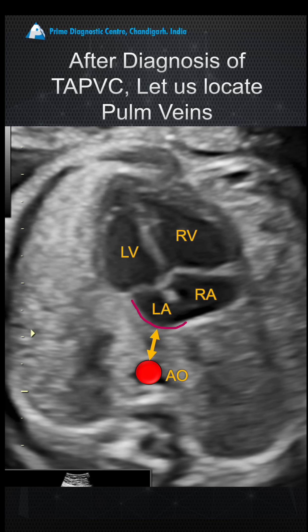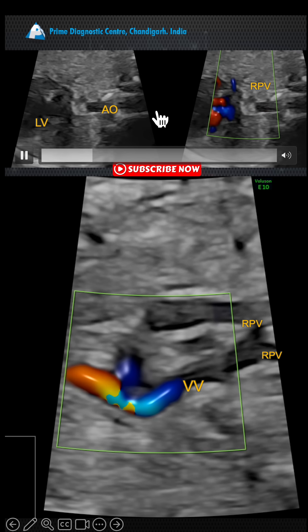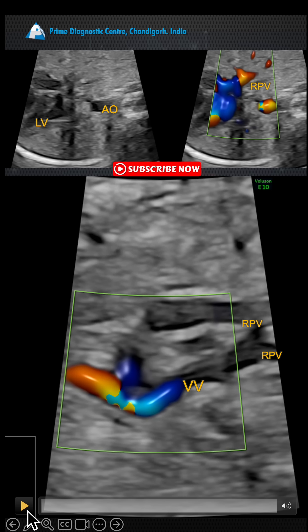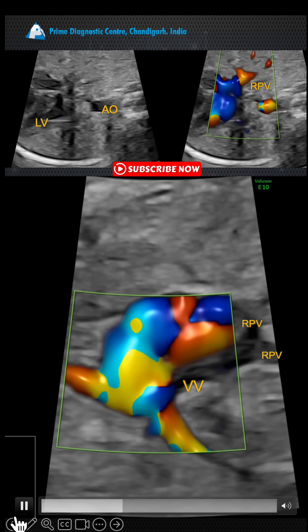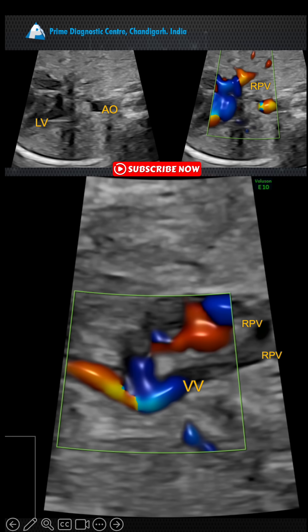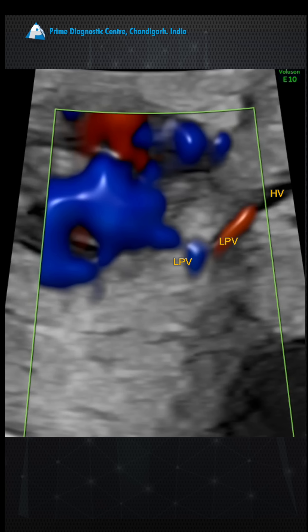This is going to be a very rare case. Look at this right pulmonary vein, which is not entering into the left atrium. Instead, you see these two right pulmonary veins draining through a vertical vein into the brachiocephalic vein. As for the left pulmonary vein, we tried to find it but could not identify any left pulmonary vein entering into the vertical vein, which led us to suspect a mixed TAPVC.